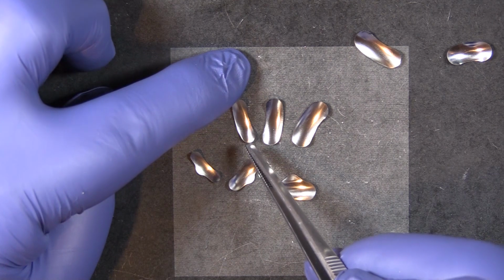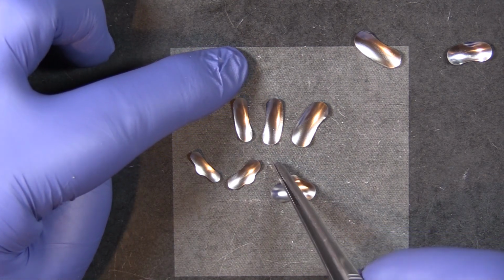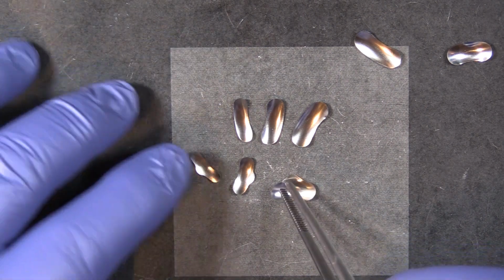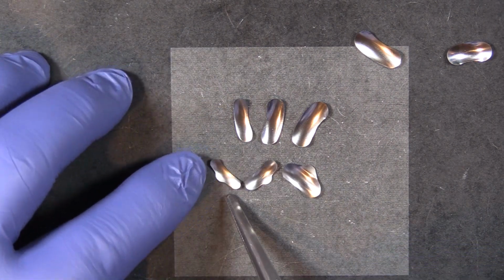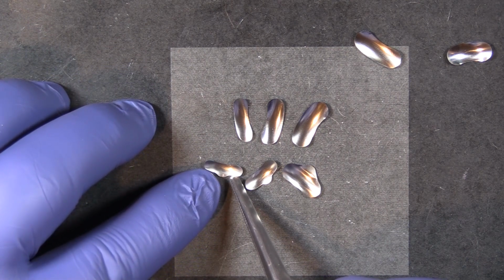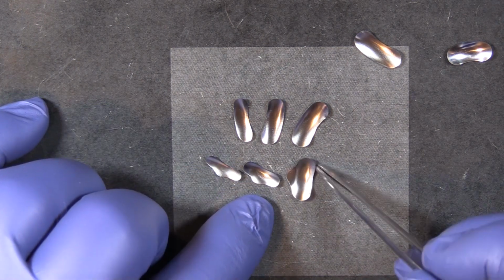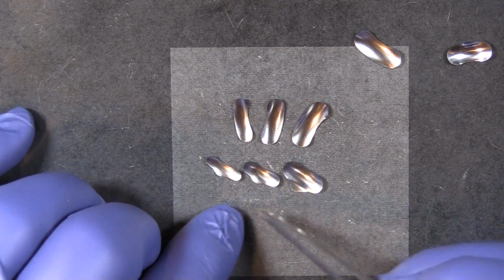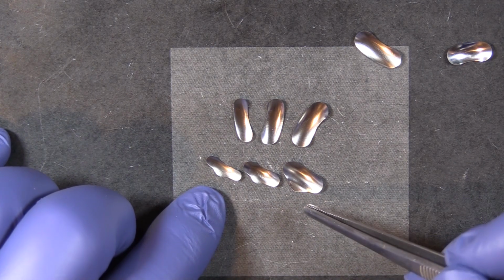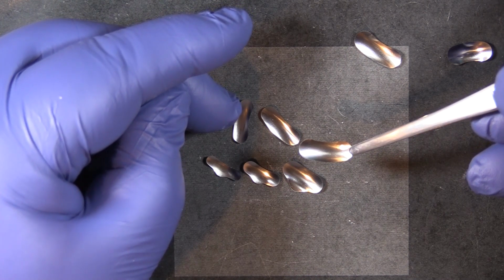Starting on the left, this is the 100 size, M100, M175, and M200. Down at the bottom, we have the M150. This is what I would call a true pedodontic size, the M150 and the M300. Of course, the ones on the bottom have the addition of the subgingival apron if you've got a little bit deeper restoration.